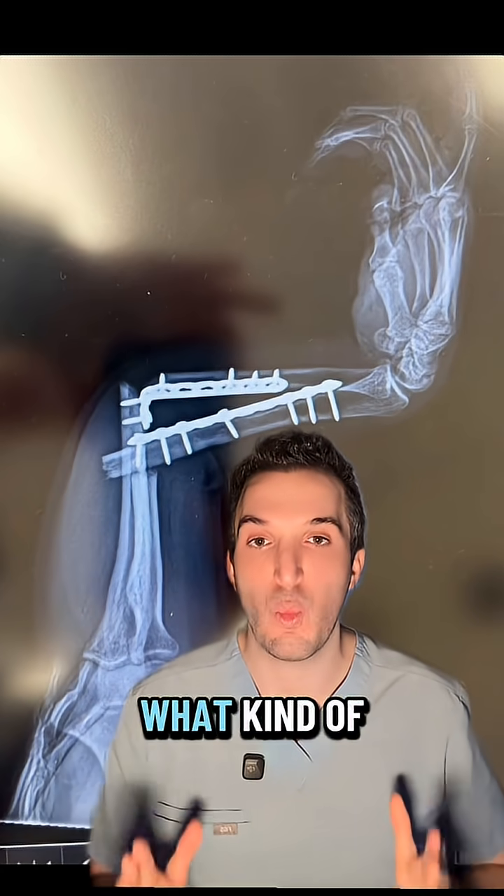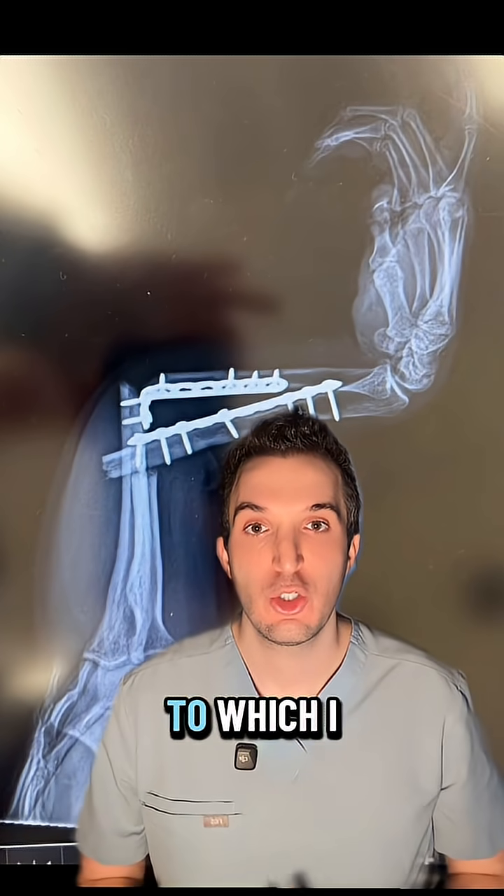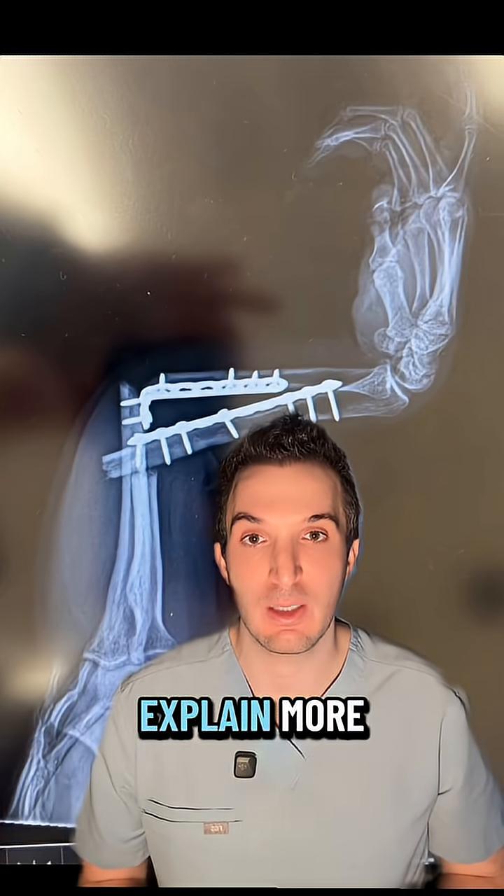At first glance, you're asking yourself, what kind of bird claw x-ray is this? To which I reply, this is actually a human, but let me zoom in and explain more.